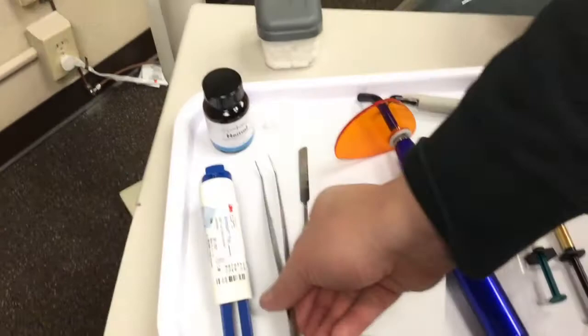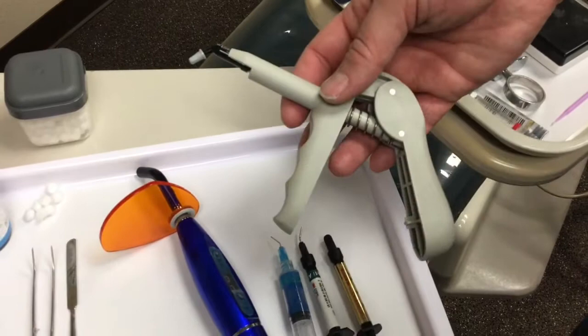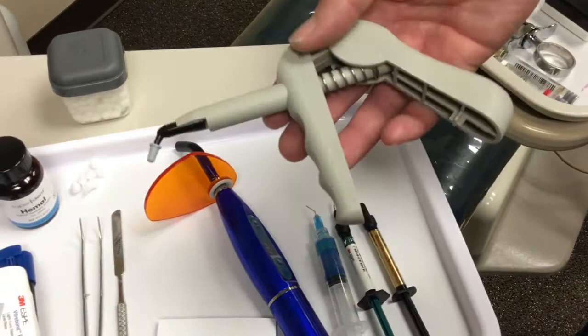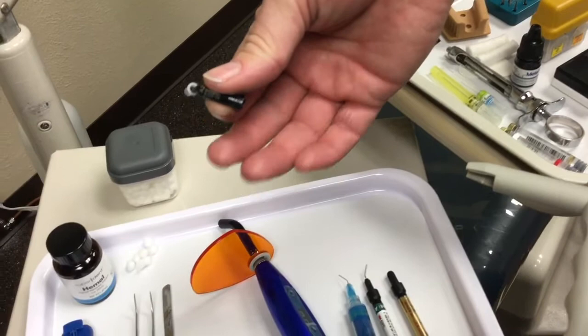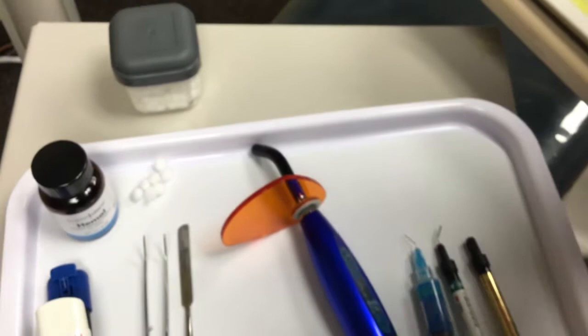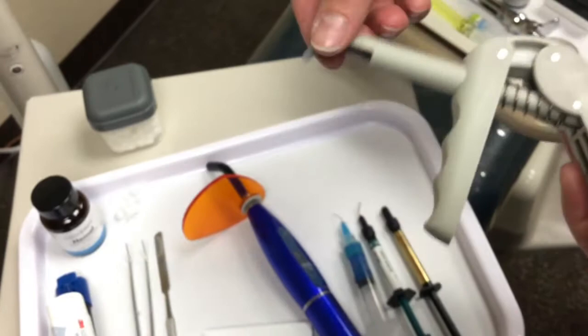If the tooth filling is really deep and we need to put something other than flowable, flowable is used mostly for shallow surfaces such as a class five or class one. But if that class one goes really deep, we need to pack and build up those walls — that's where packable composite comes in. It usually comes in little capsules like this; it's going to have the shade on it — this one is A2. We also have our composite gun, which you just pop the capsule into. It has the versatility of going in any direction so you can hold it and get into tighter surfaces. It's very ergonomic in that way.